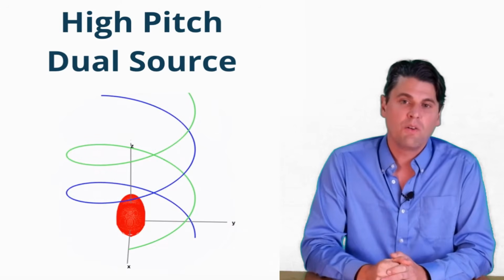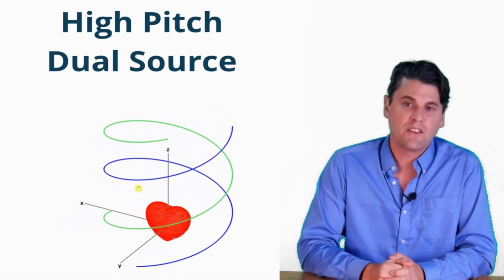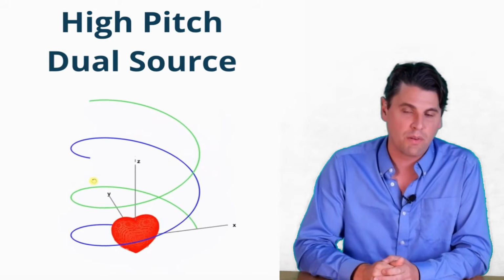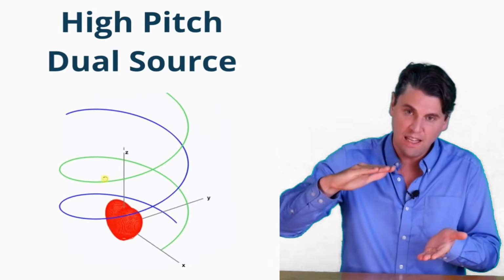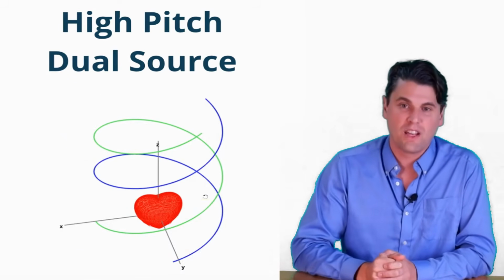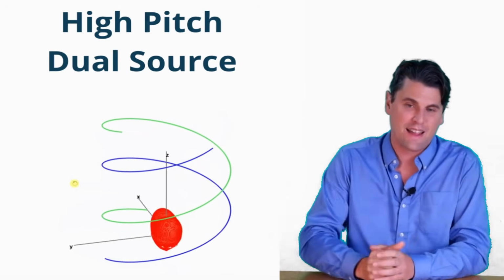So in this scenario, you actually aren't doing the same gating where everything in the volume is at one given phase. In this scenario, you're just reconstructing based on the data that you have, in more of a typical helical acquisition. So in that scenario, you're actually changing the phase as you move down in the volume. As the data range is changing, you're changing the cardiac phase because the position that you acquired the data at is actually linked to the time.